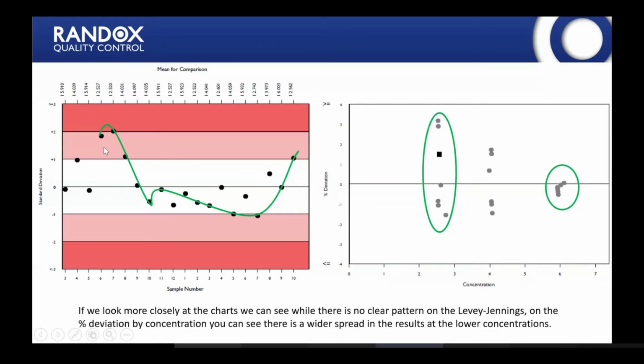Again, we can't look at any chart on its own. We need to look at all the charts in correlation with each other, because each one will give you a separate new piece of information, and it's important to interpret them all together. This is the lab's Levy-Jennings chart with this funky little line showing how the performance has moved. But if we look at the percentage deviation by concentration chart, we can actually see that there is a different pattern. At the higher concentration, the lab has very tight and very good performance. But at the lower concentrations, there's a much wider spread in the results that the lab are getting. So this is the area that they need to watch out for.